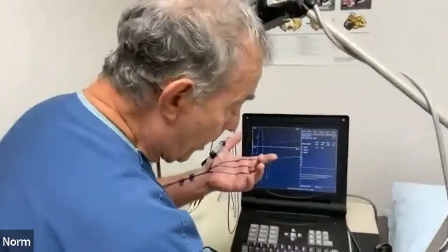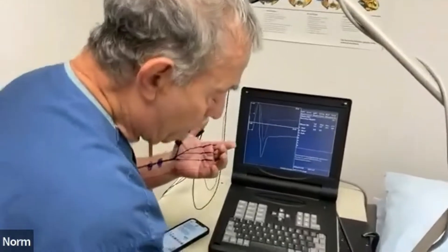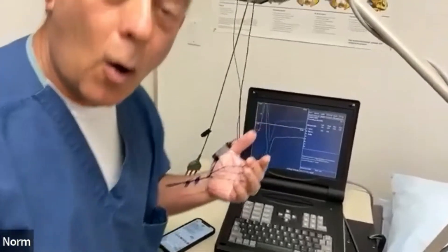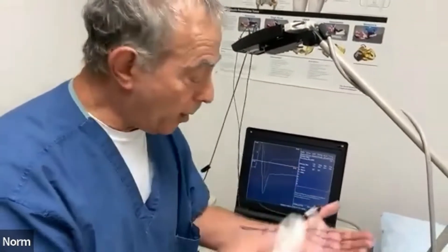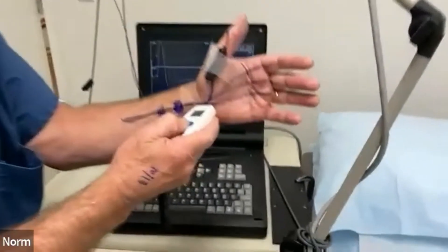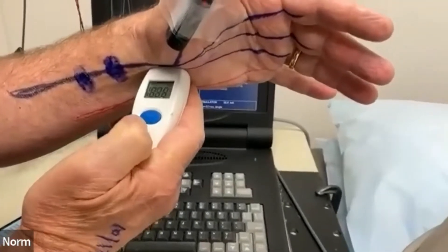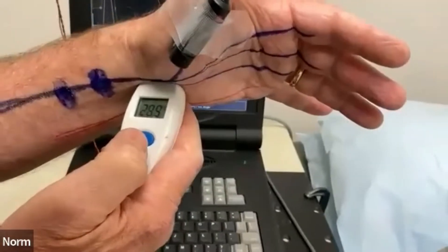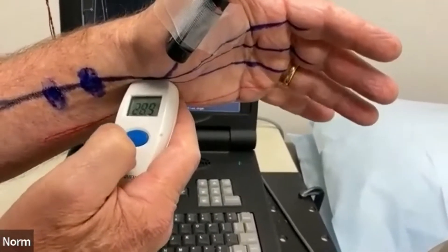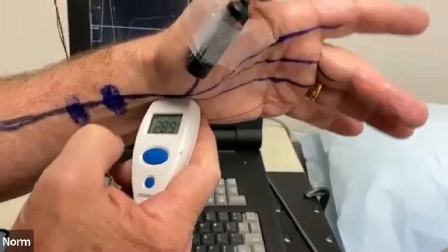I have to make sure that the temperature in my hand is measured, because if my hand is cold, the latency is going to be spuriously slow. So I'm going to check the temperature — I want it to be somewhere around 29 or 30 degrees. This is a little temperature probe. The temperature in my hand is 28.9 degrees centigrade, so that means that this test is pretty accurate.